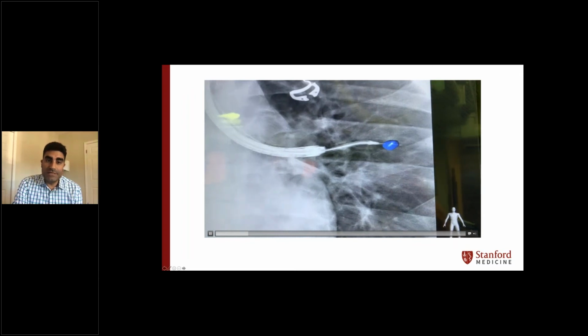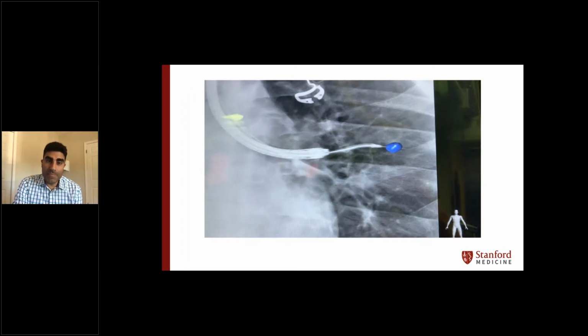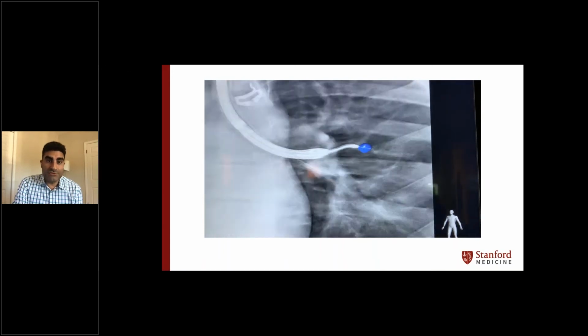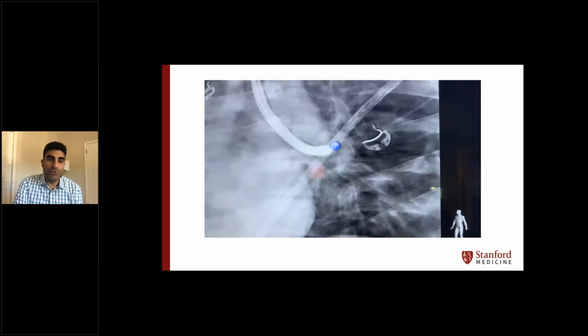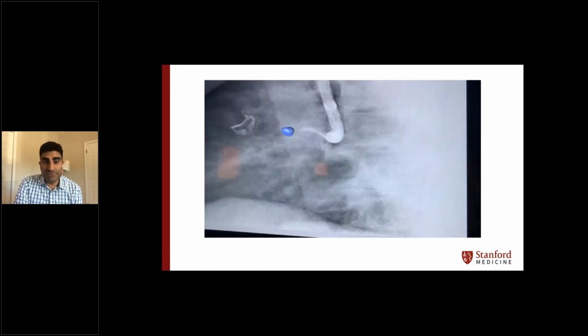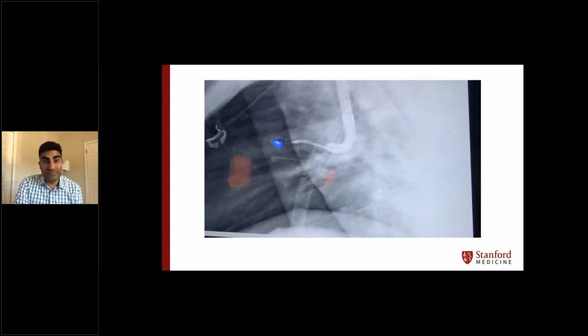you can see that my needle is going through the target. And as we rotate and sweep 90 degrees, my needle stays within the target completely. And that's what proves that I'm actually within the target. Now, after I achieve this on fluoroscopy, I will do another CT spin to confirm that my needle is actually within the target. That's why, because as you can see, this target is only about 8 millimeters. So we can't just go off of this single sweep that we're done. I want to use a CT scan to really confirm that I finished everything.